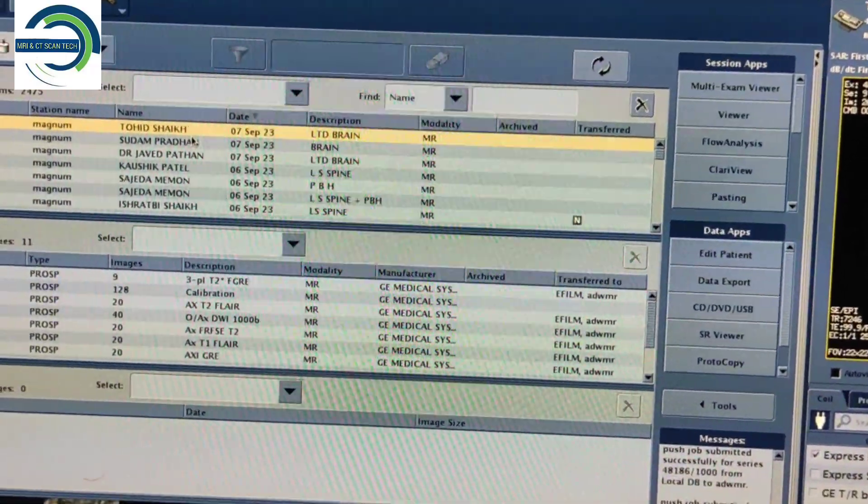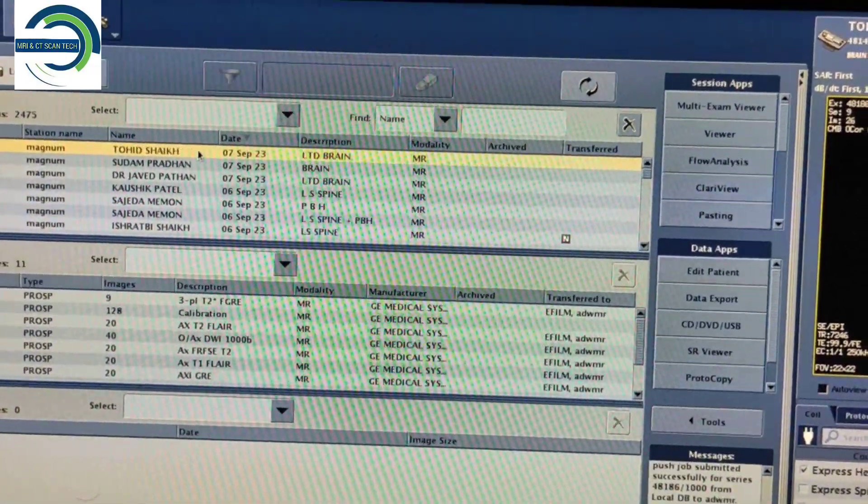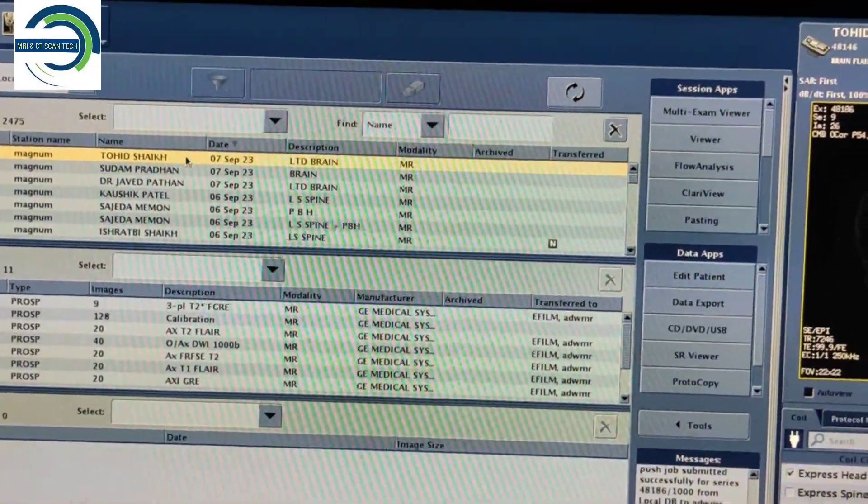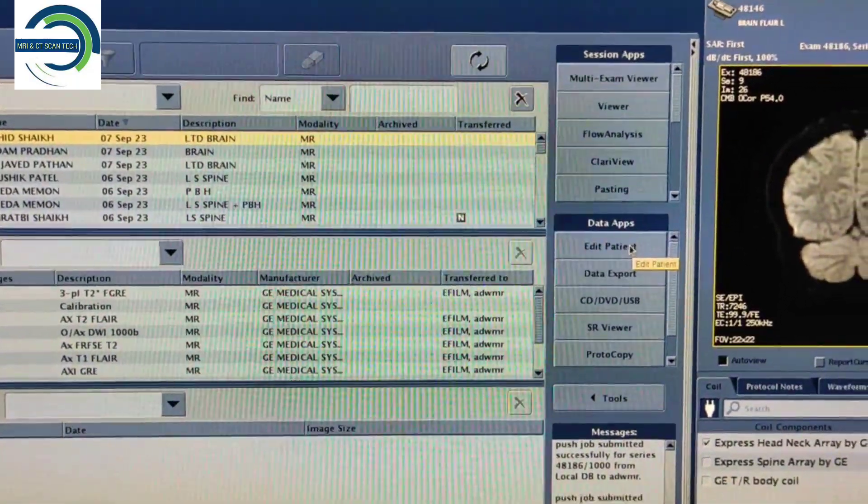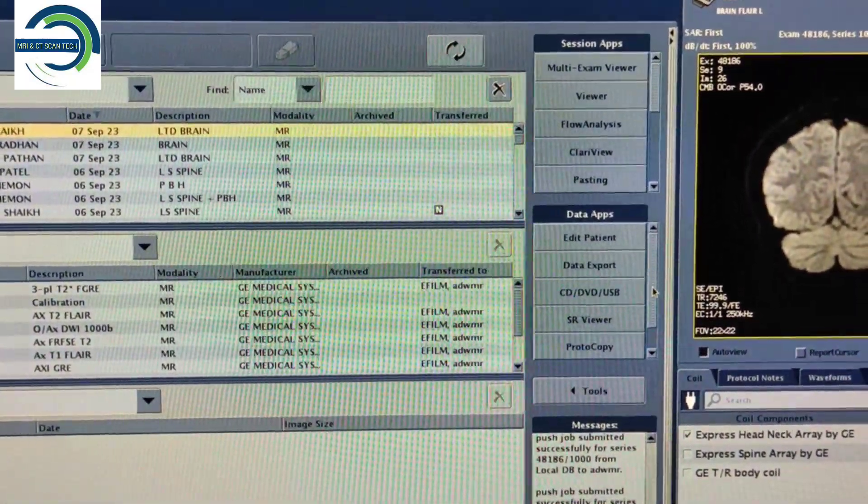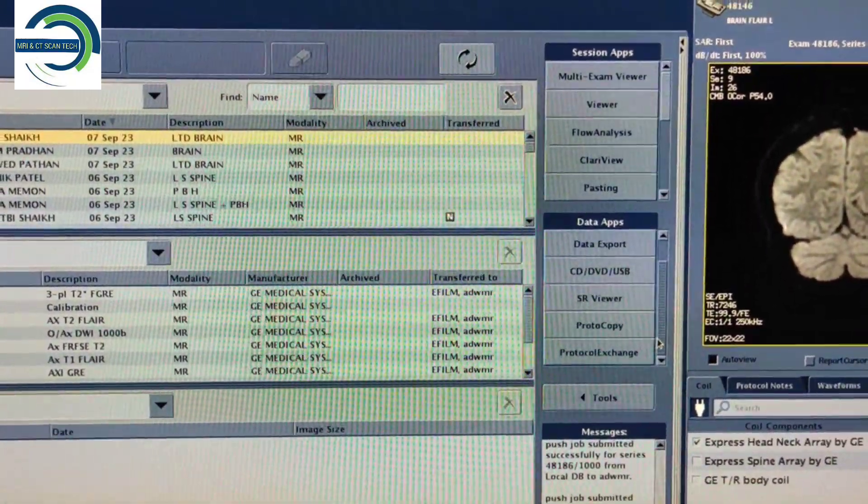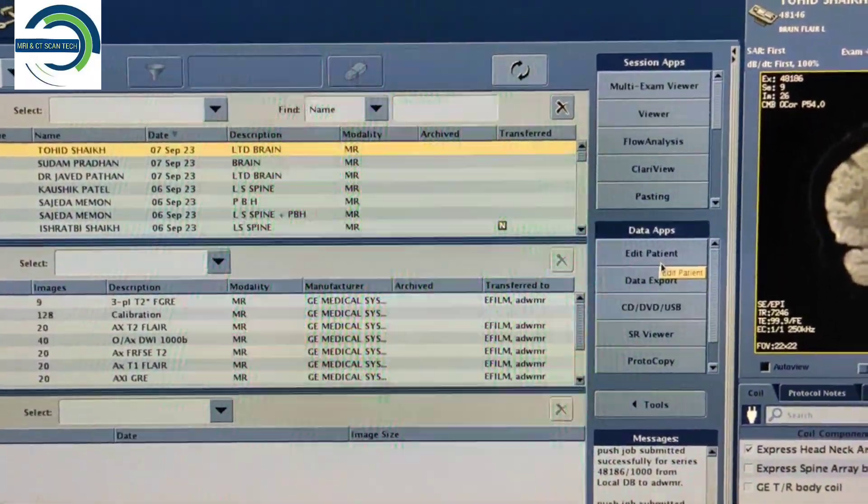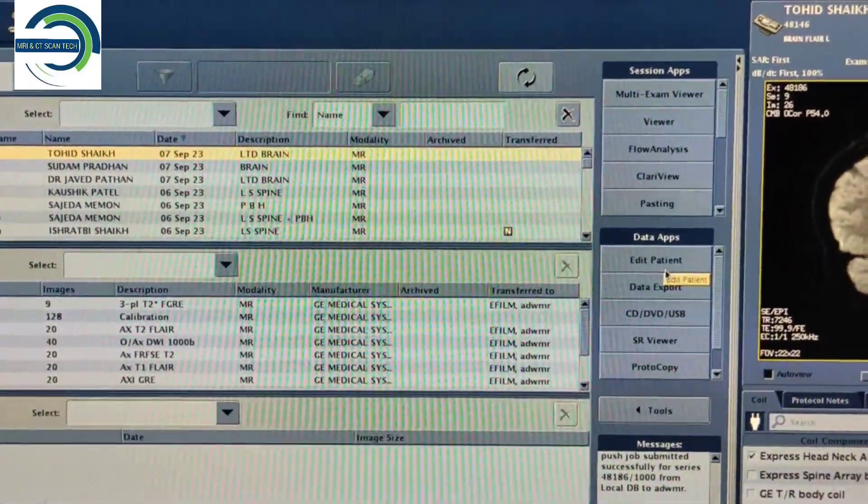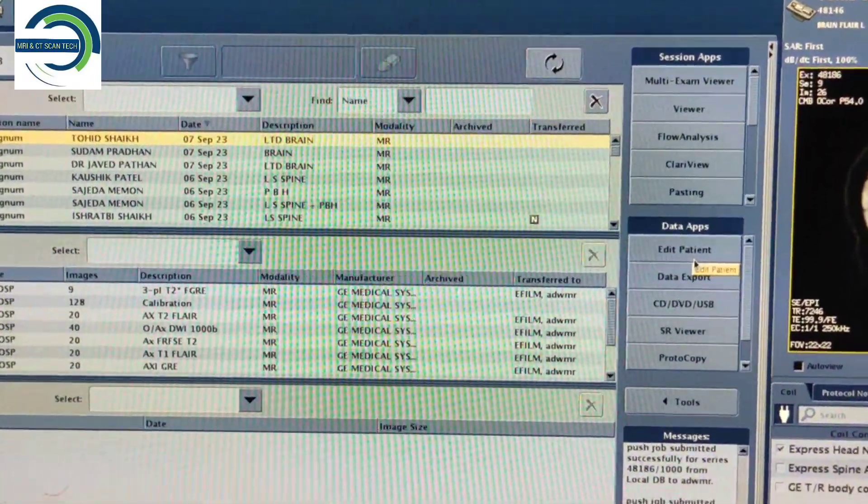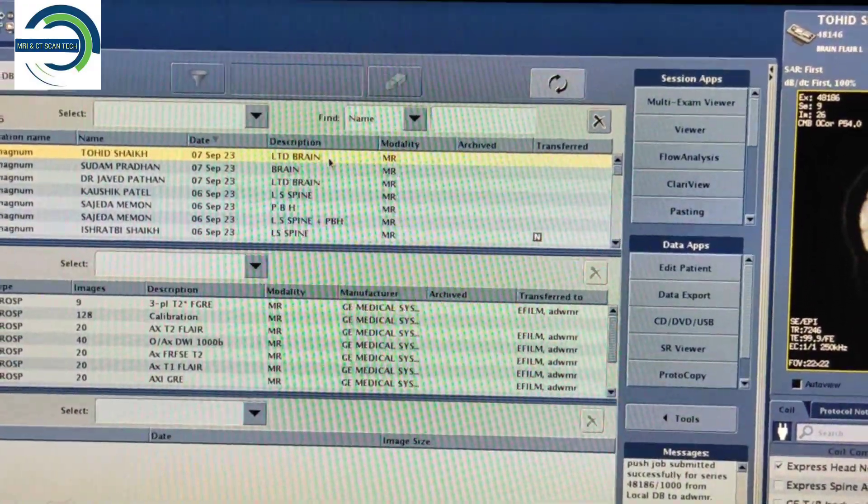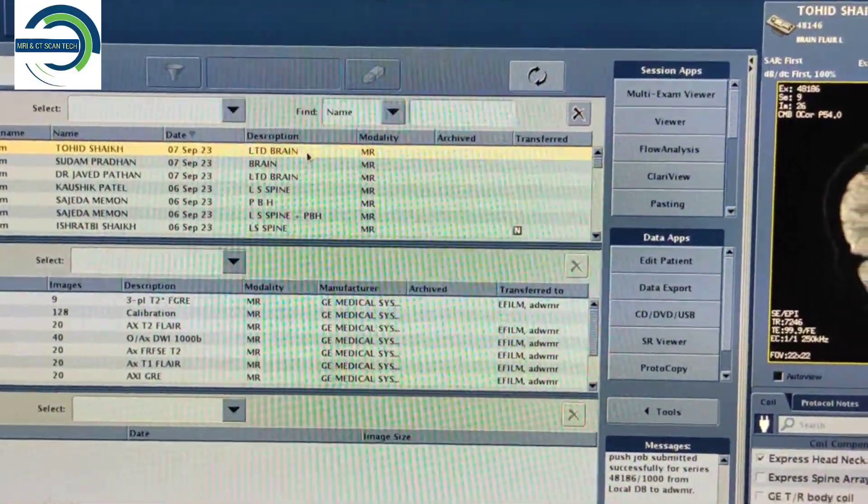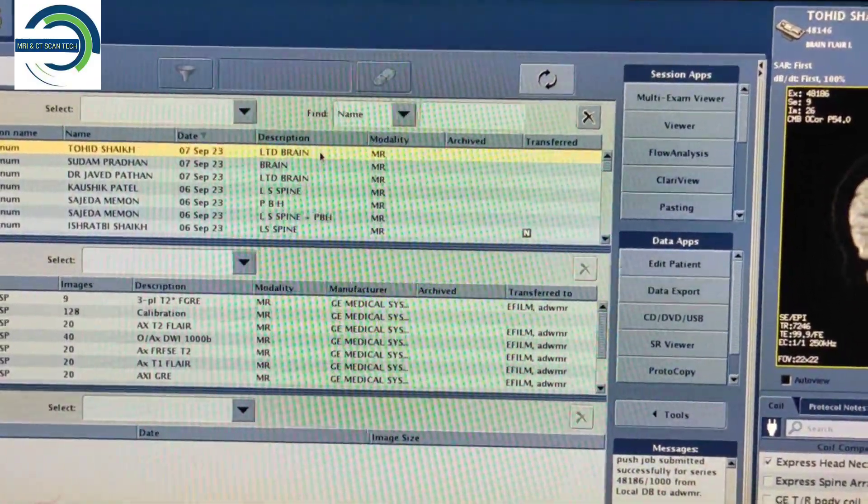First of all, you have to select the patient name and click on Data Apps. You can see here is the Edit Patient option. You have to click on the patient name which you want to change.